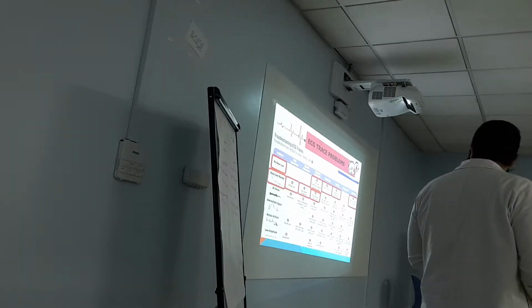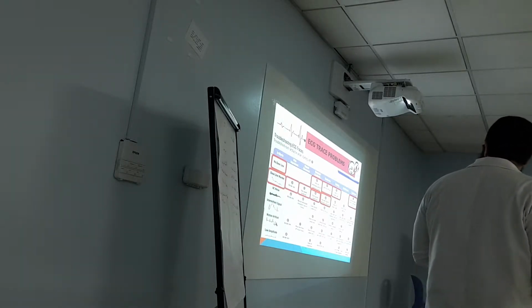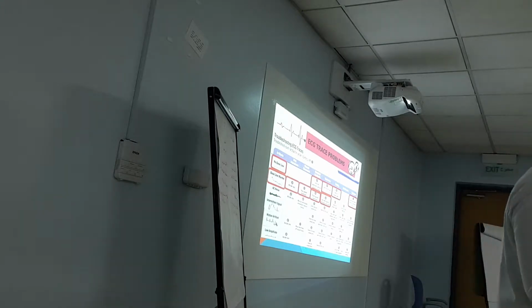And you are not using the same type of electrodes. So your electrodes must be from the same manufacturer. So if you open a new package, you attach 3 leads, and you open a new package with a different manufacturer and attach it to the different positions, the machine thinks the same reading is coming from all these leads, same manufacturer, because of the calibration, okay, for these leads, it will produce a certain electricity rating, okay?